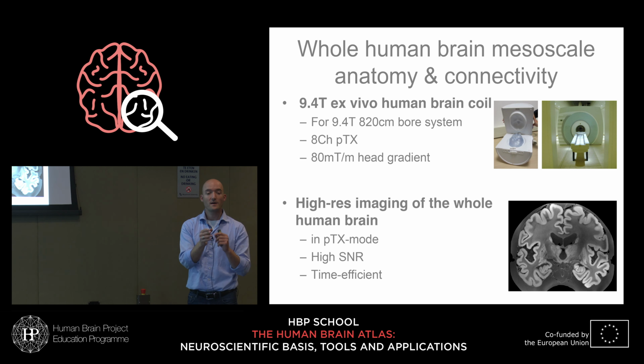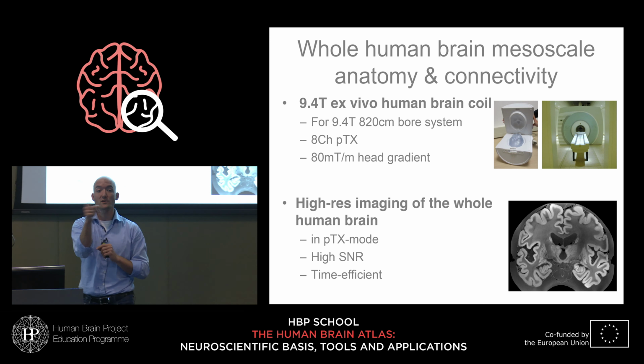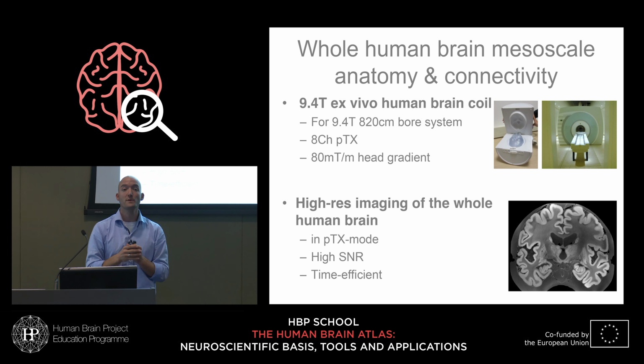And so it runs with a very small readout every time, where it gets a little part of the data every time. That's basically because if you try to do a really long readout, like an EPI readout, where you hear this entire beep, when you hear fMRI running, you hear beep, beep, beep, beep. Each one of such beeps is 40 to 50 milliseconds long, and it's the scanner reading out the entire k-space, or your entire slice image. That only works because the signal in the in vivo brain is there long enough to be read out for 40 to 50 milliseconds. Ex vivo, you can only read out signal for maybe 10 to 15 milliseconds, so you have to make really short readouts. That's already one thing that you have to do.